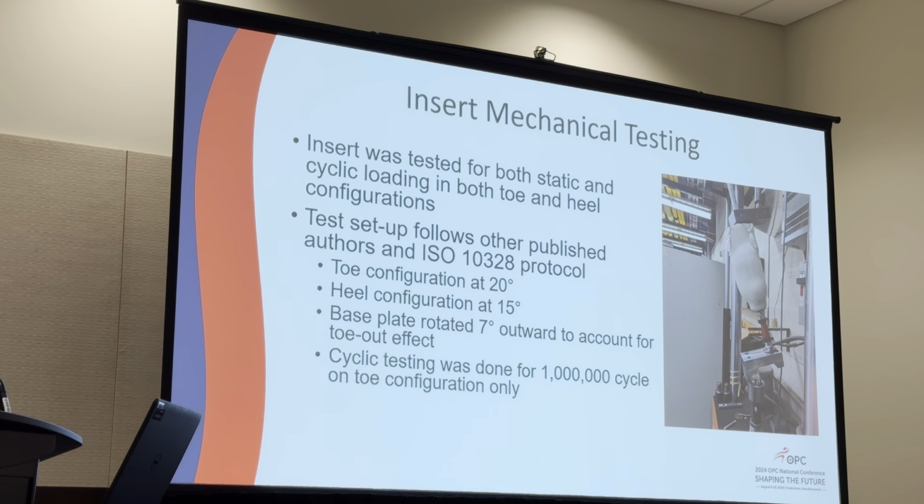And then for the heel configuration, it was completely different, where again, we're applying a force on the back end of that base plate. We would then apply the load, again, get it up to the required force, let it creep for 30 seconds, and then let it rest for 15 minutes before moving on to the next load.